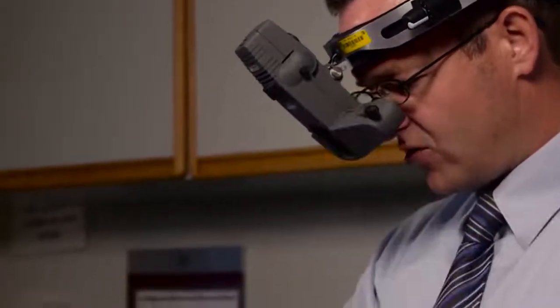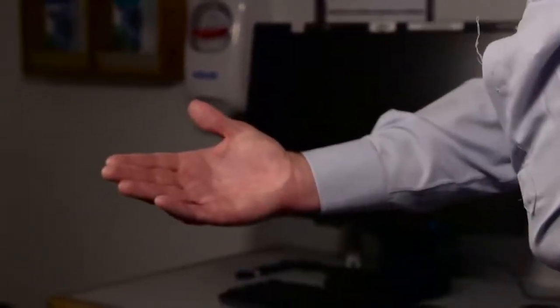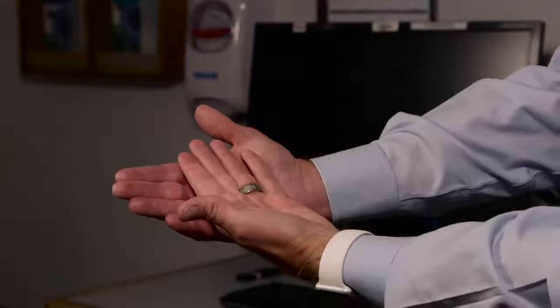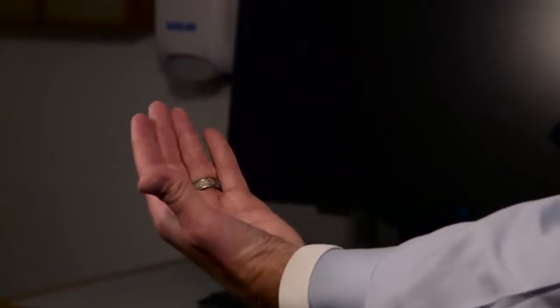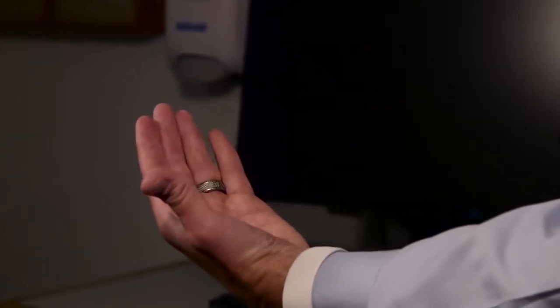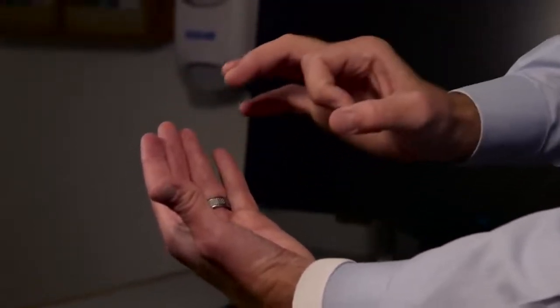All right? And then as you look through, you're going to see a beam of light. And I'm going to turn that up to its highest because we're kind of lit up here in this room. In a dark room, it'll be a lot easier to see. The beam has different sizes. There's a wide beam, a medium beam, and a small narrow beam. So 3 different sizes.